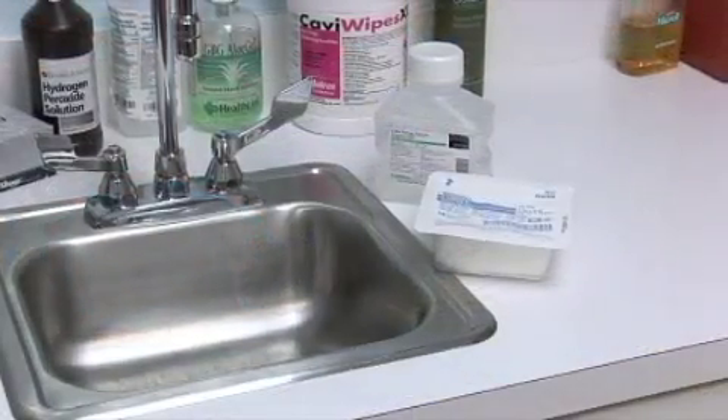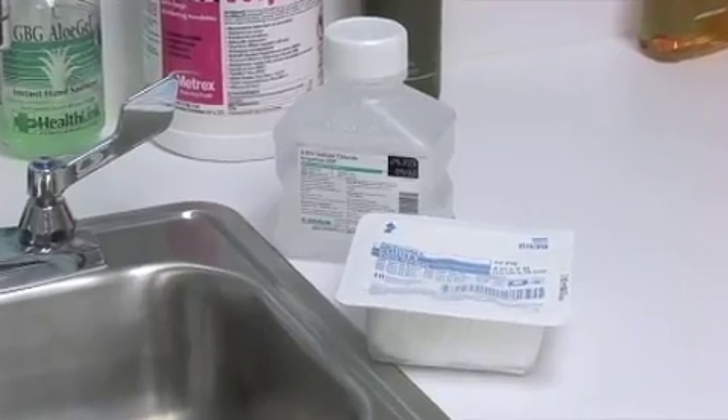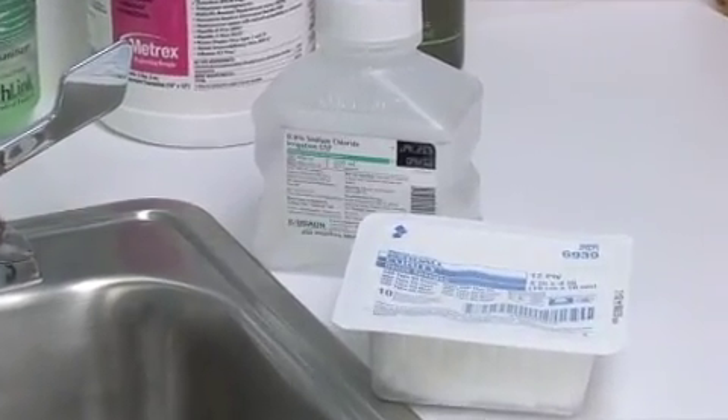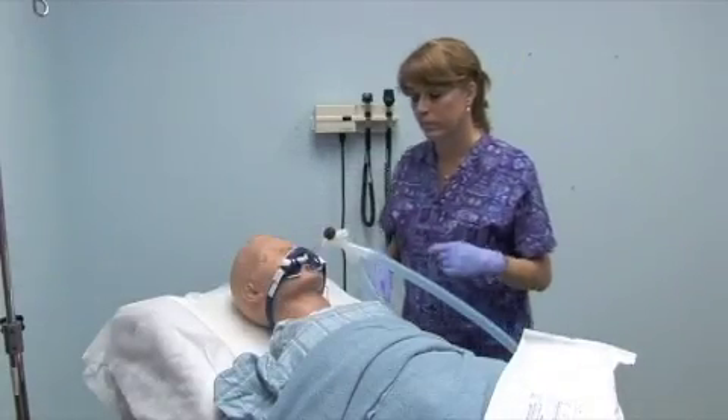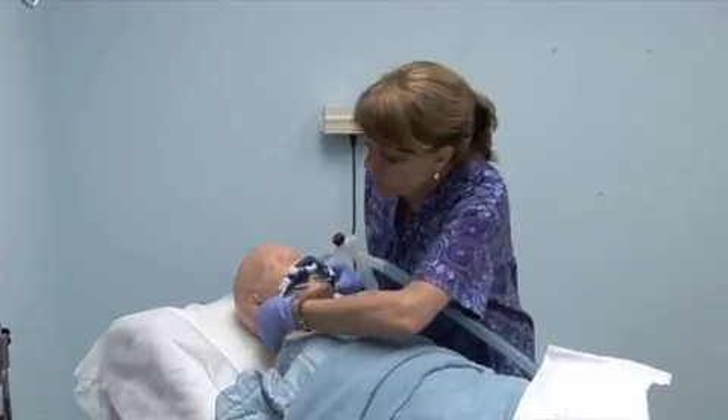In the rare event that you need to rinse the Rescue Cath mesh for a second immediate use, you should have access to sterile saline at a sink basin. Ensure the patient is tracheally intubated with an endotracheal tube that is in good position and properly secured.